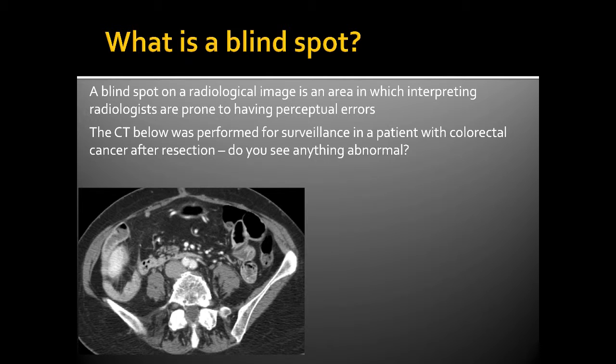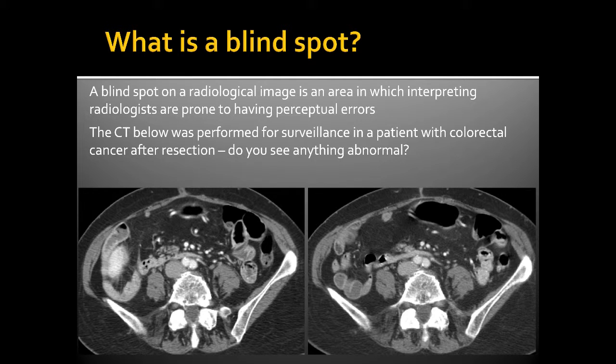The CT below was performed for surveillance in a patient with colorectal cancer after resection. Do you see anything abnormal? I'll give you a hint. Look at the omentum. How about on this image?